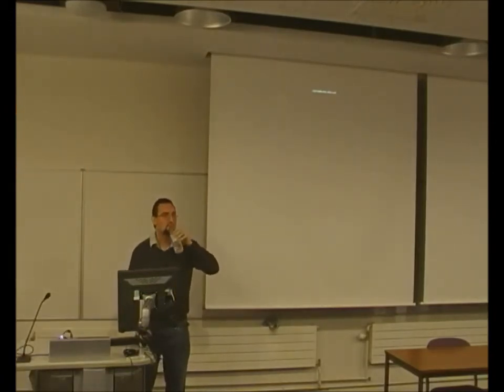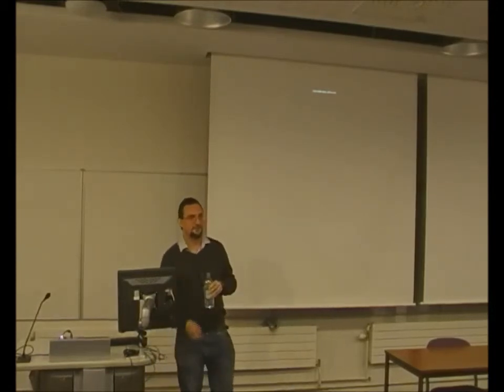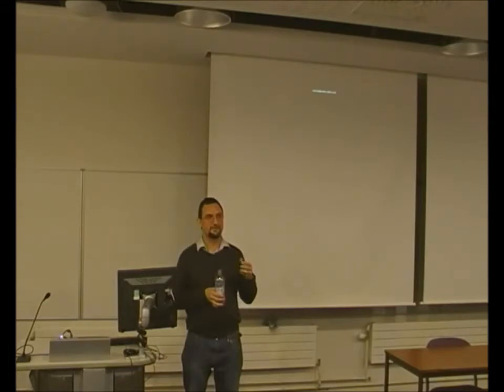Tim, the standard deviation around these estimates was of the order of plus or minus 10 dB? Yeah, 10, 20 dB, something like that. Which is about the same as the rest of the literature. And not that dissimilar to ABR though? Yes, actually. Although it doesn't look great, we have to remember that ABR is not that much better, especially at low frequencies. That's very true, and there's a lot of criticism of ASSRs about this kind of thing, and a lot of research going into it. If you really look at ABRs, it's the same problem. Trying to do threshold estimation in ABRs in adults doesn't work very well either. So that's a clear point.